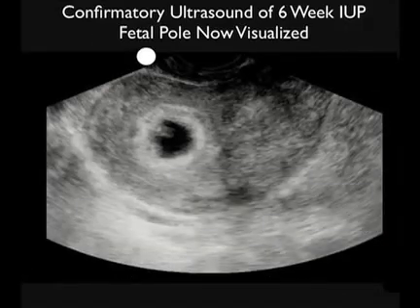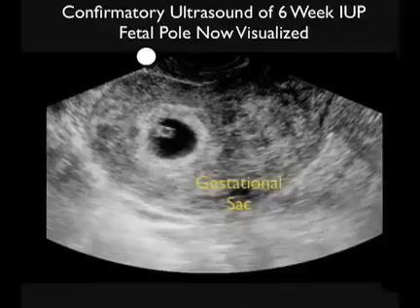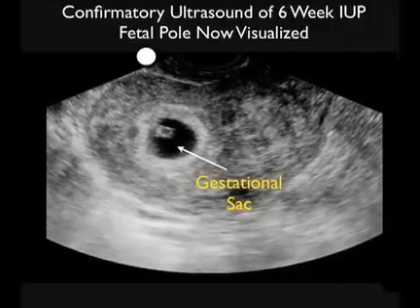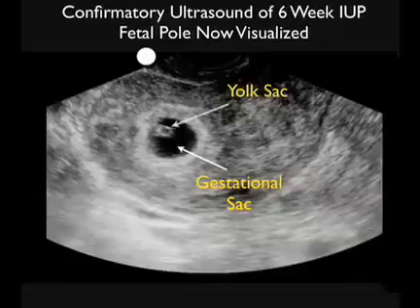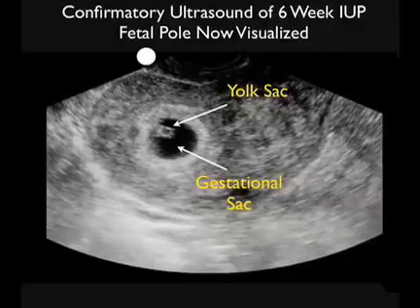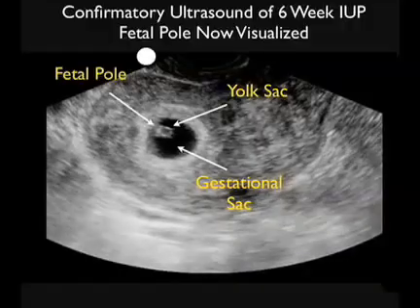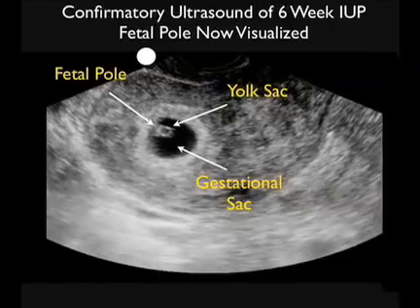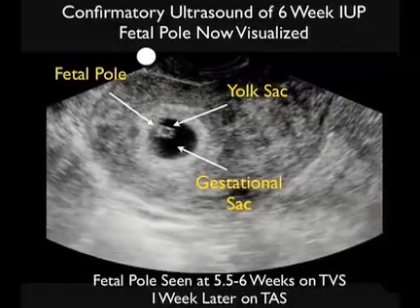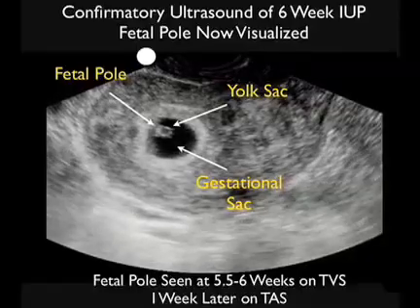Here's a pregnancy that's a little bit more advanced, and here we see a large round gestational sac, that dark or anechoic structure, and inside the gestational sac we can see the circular yolk sac or Cheerio sign. Let's look just to the left of the yolk sac here, and now we appreciate the presence of a tiny fetal pole. Interestingly enough, when we magnified the fetal pole, we could actually see a tiny heartbeat. Now, the fetal pole is generally seen at about 5.5 to 6 weeks on transvaginal sonography and 1 week later on transabdominal sonography.